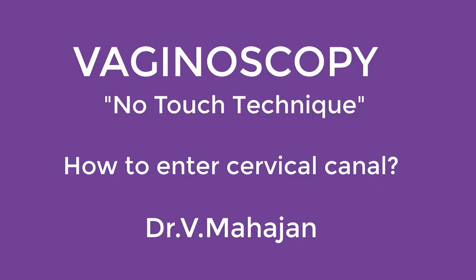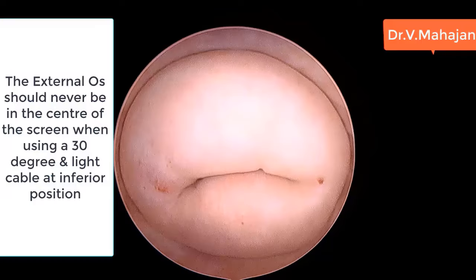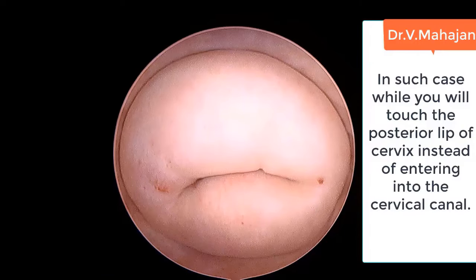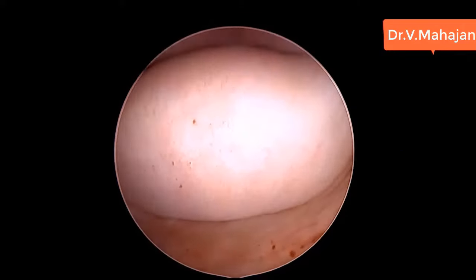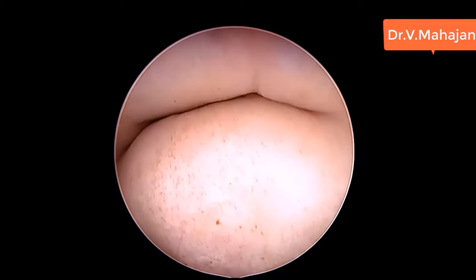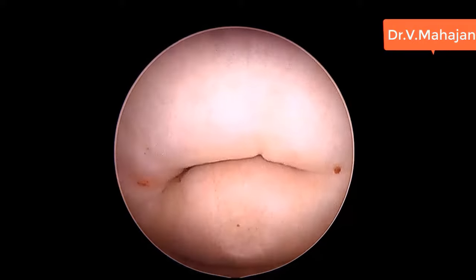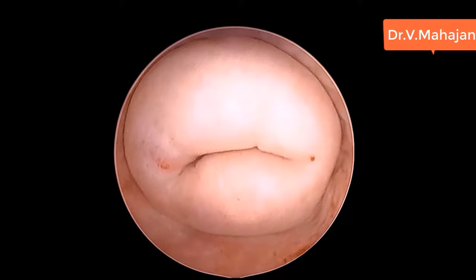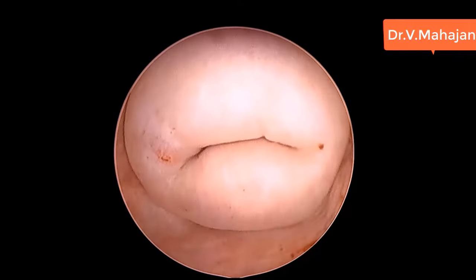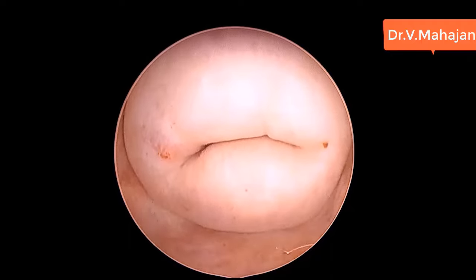How to enter the cervical canal in a vaginoscopy technique: when you distend the vagina with the fluid medium and approximate the labia, if you are keeping the external os in the center as shown in this video and you try to enter the cervical canal, invariably you hit the posterior lip.